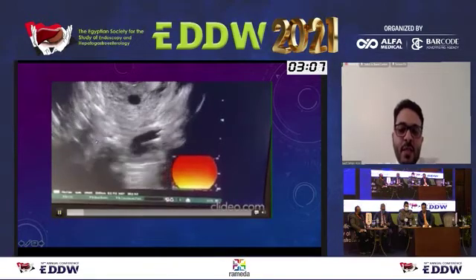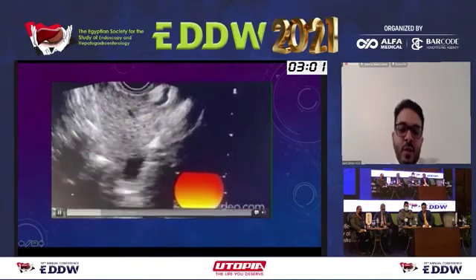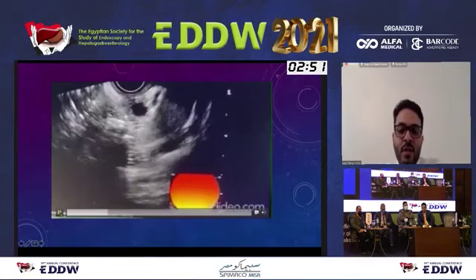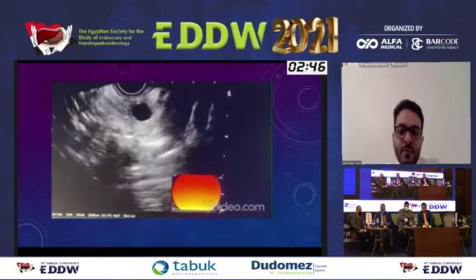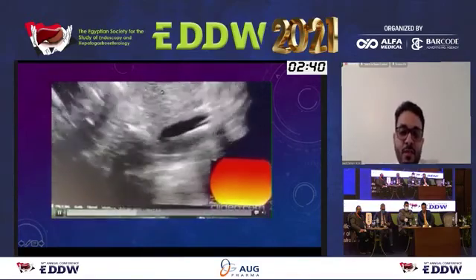She has a cyst in the neck of the pancreas, as you can see here, a small cyst measuring 1.1 centimeter and communicating with the normal main pancreatic duct. This cyst has no worrisome features in terms of mural nodule or thick wall, and you see the pancreatic tissue is normal around. Trying to examine the rest of the pancreas, you see here the normal pancreatic tissue. There are no changes of pancreatitis.